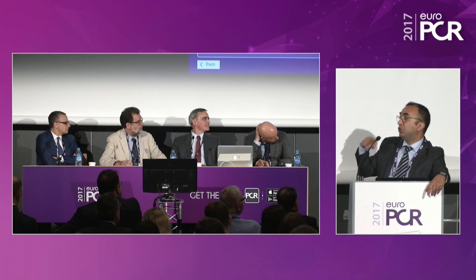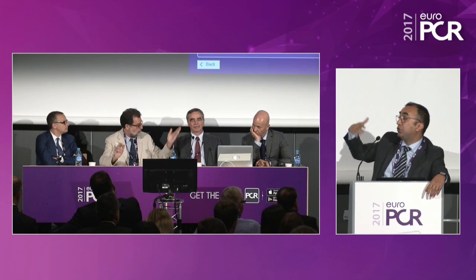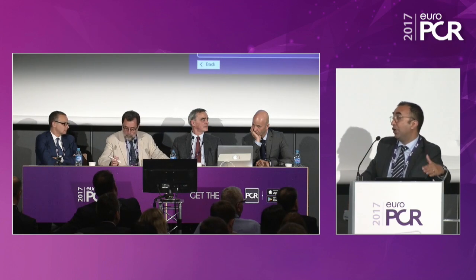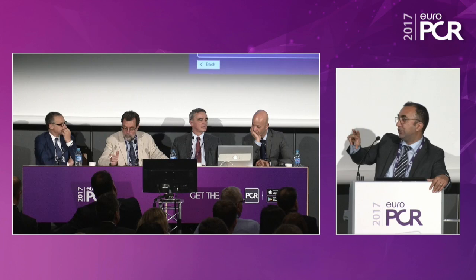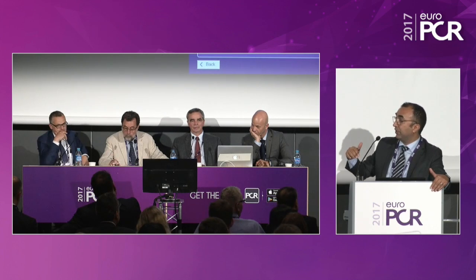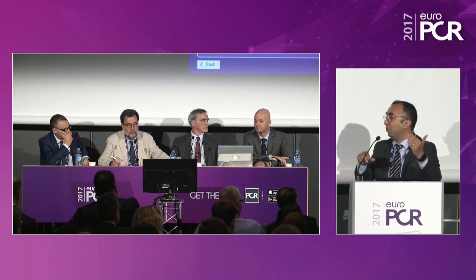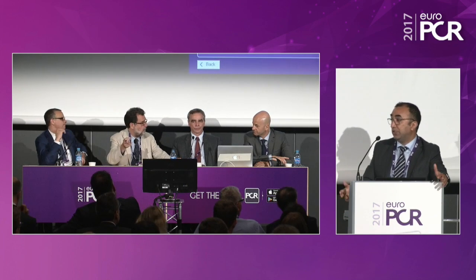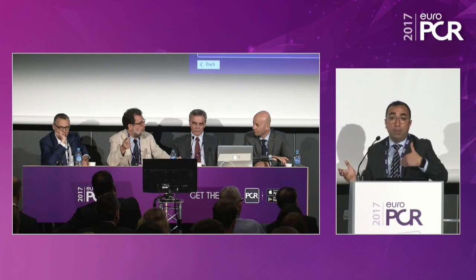So maybe, Francesco, maybe I can comment on that, please, because we had a similar case, and I think we should be challenging. You know, there are those predictors of failed annuloplasty or recurrent MR. We should be challenging that based on that fact. You know, we've had a case with asymmetric tethering, which should not have worked, and it was interesting as we got to 3.5 of cinching 4, the MR decreased. Okay, there was still some MR, but when we cinched even more, the MR increased again. And so we were able then to go back to the result we had before. So I think we're going to challenge a lot of those predictors of failure in the future, because you can adjust and you can go back as well.